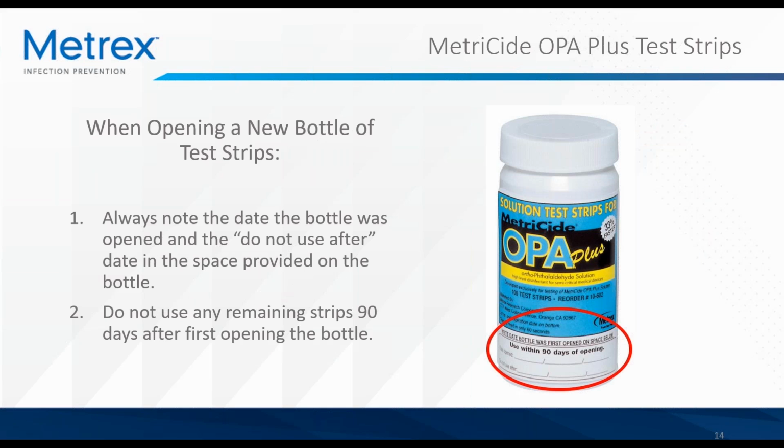When you open the bottle of MetriCide OPA+ solution test strips, you can see in the picture here that again on this product label, you have a spot to write the date of opening. Once the test strips bottle is opened, the test strips need to be used within 90 days of opening. Again, this is a time to ask Siri or Google, what is the date 90 days from today? It's not good practice to assume that 90 days equates to 3 months. It's important to be precise.